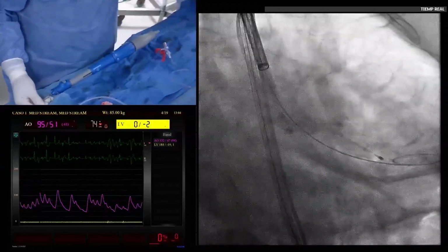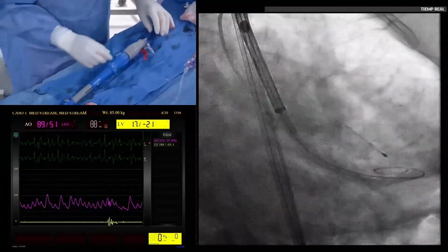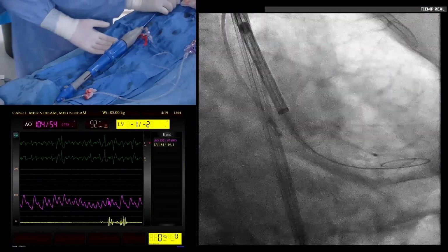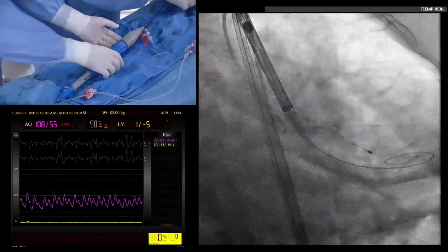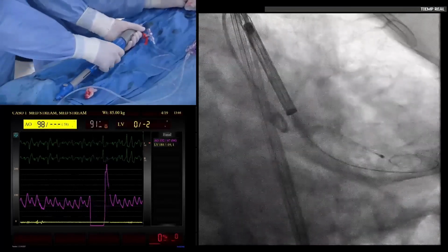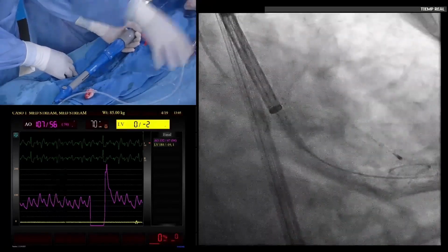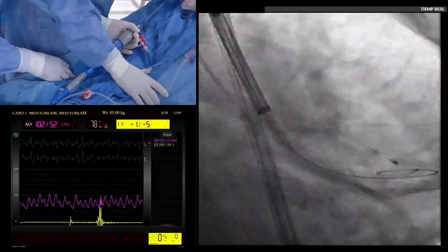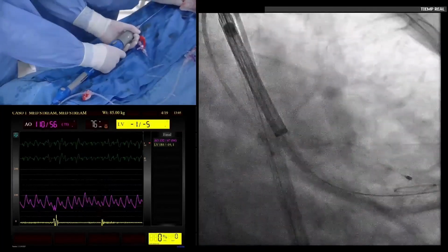So the advance is very smooth. We will park in the middle part of the pigtail loop. Move there, Juan, guarda. Be prepared with the pacing, 120 or probably 140 because she is with some tachycardia. Test, Juan. Small test. You can. Let's do a zoom. One zoom. Perfect. And move a little bit down the patient. Mueve la cama. There. Perfect. So we can start very slowly, Franco.